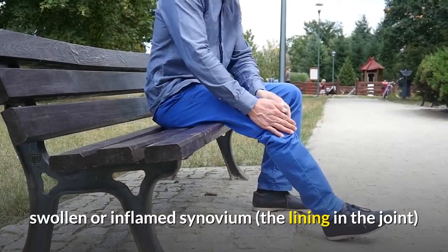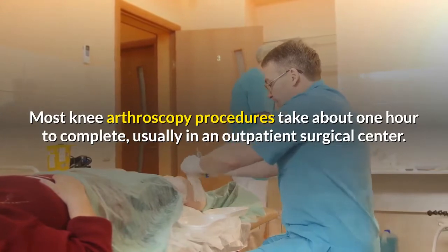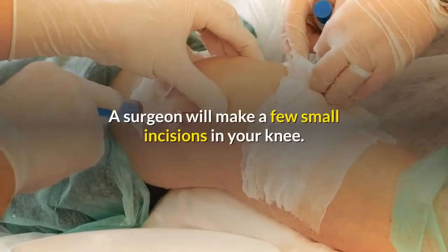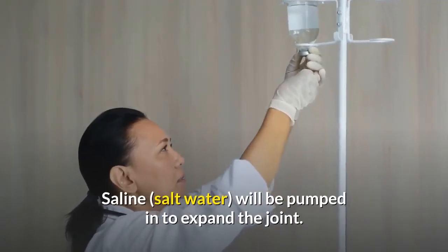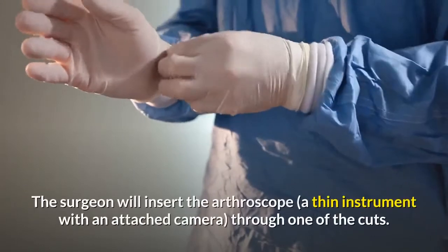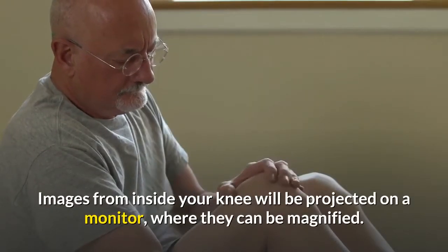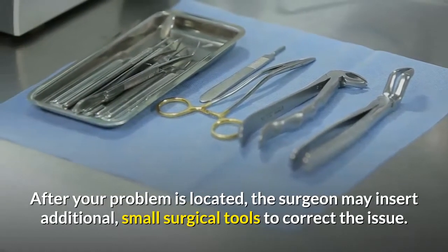Most knee arthroscopy procedures take about one hour to complete, usually in an outpatient surgical center. You will be given anesthesia — in most cases, local. A surgeon will make a few small incisions in your knee, and saline (salt water) will be pumped in to expand the joint, creating space to help the surgeon see and maneuver inside. The surgeon will insert the arthroscope — a thin instrument with an attached camera — through one of the cuts. Images from inside your knee will be projected on a monitor where they can be magnified. After your problem is located, the surgeon may insert additional small surgical tools to correct the issue.